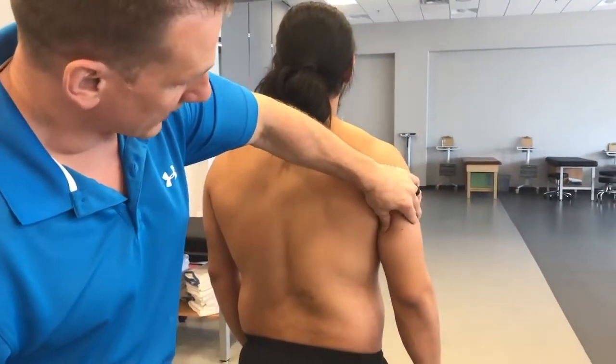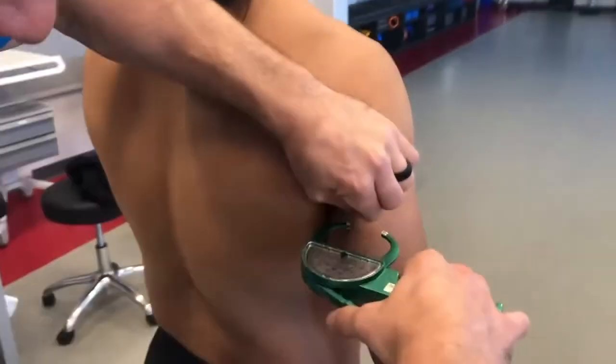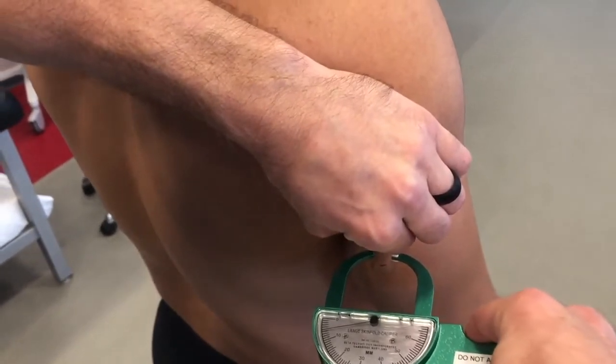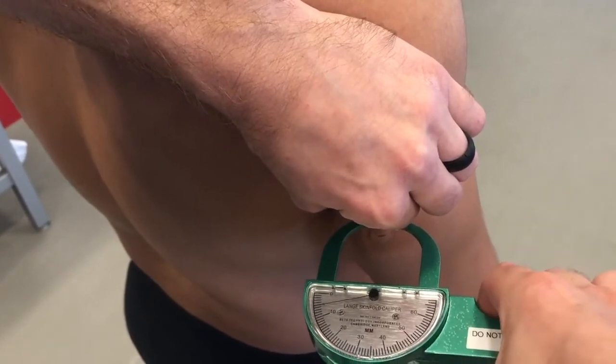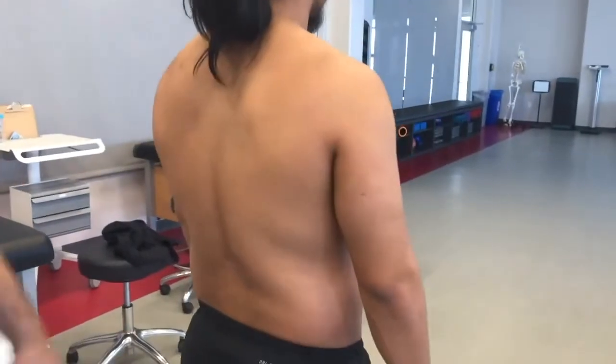We're going to move on to the tricep. I'm going to take a pinch above the actual mark and put my calipers on so that it's midway between the pinch. Wait two seconds — 1001, 1002 — we're going to take our measurement at five millimeters. Undo the caliper, let go, and let him relax.